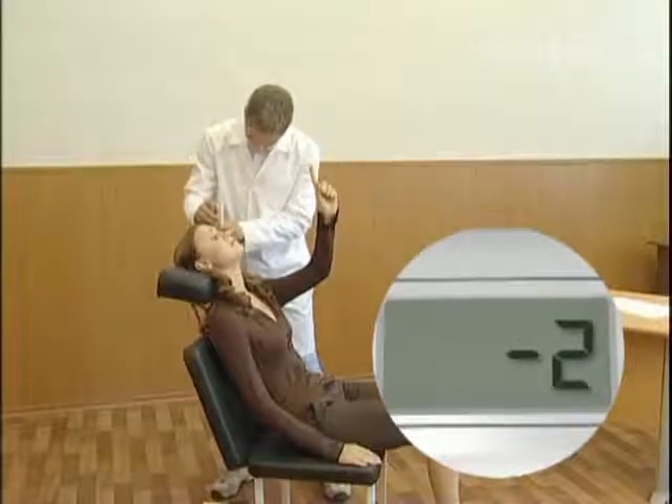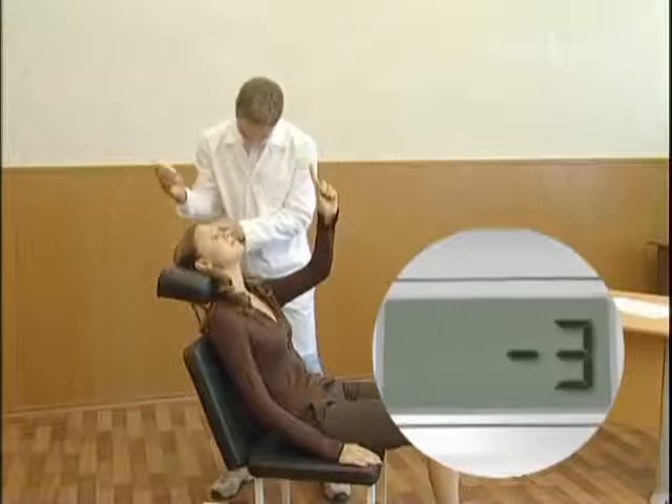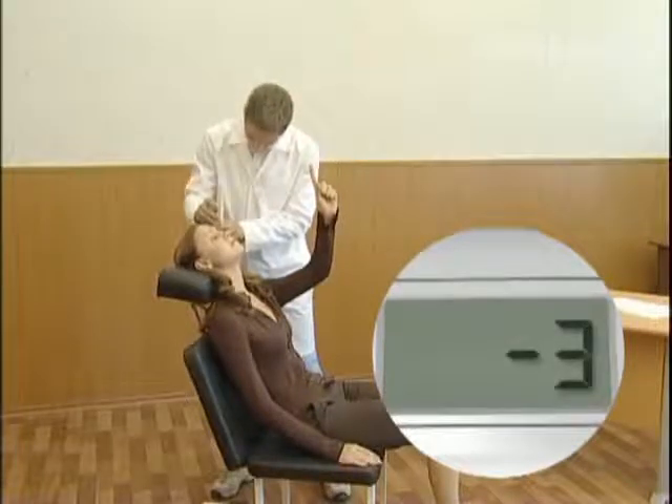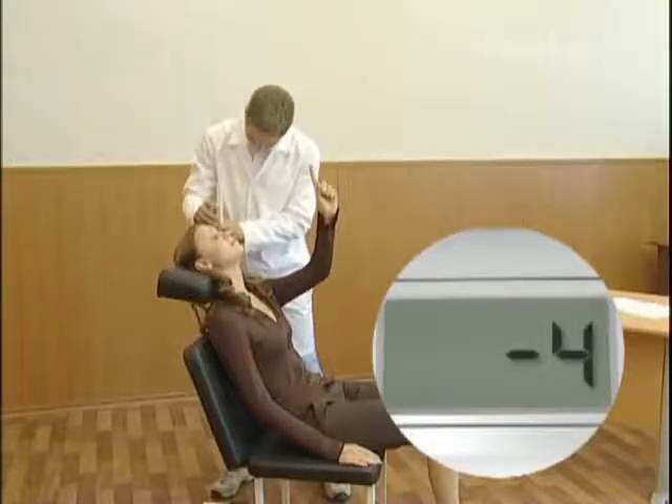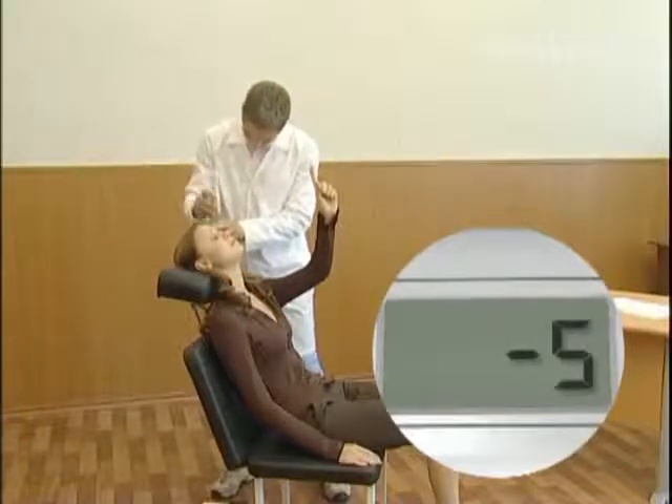Depending on the precision with which the method is followed, a measurement series may contain from two to six measurements. Two long sound signals indicate that you have finished a series of six measurements.